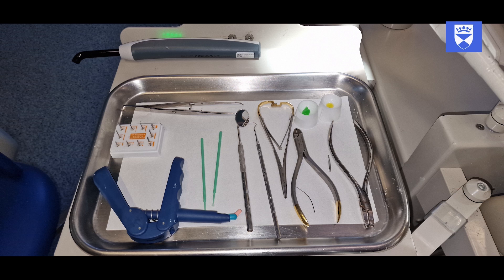This video will demonstrate a predictable and reliable method of placing a composite and wire splint to manage traumatic dental injuries.